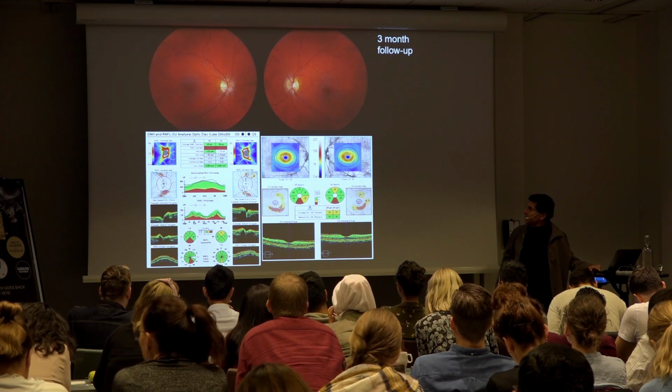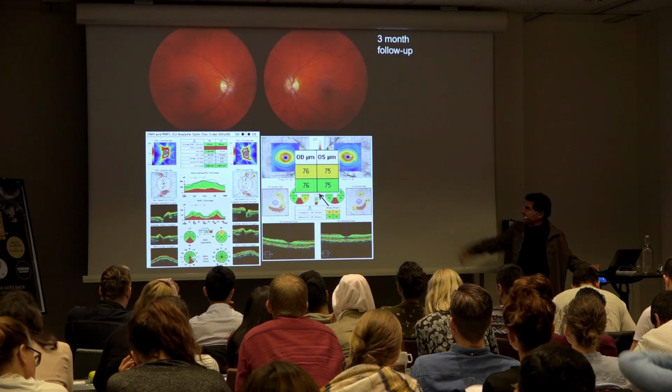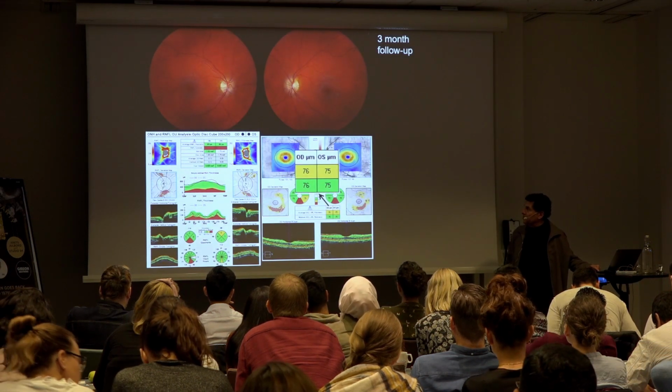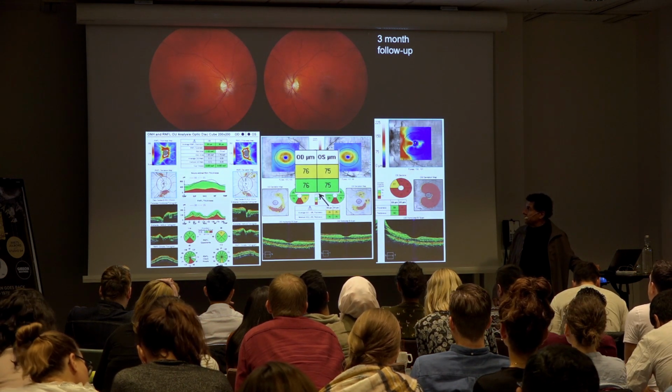So that patient had a 3-month follow-up after the disc edema went down, and you can see how the ganglion cell layer doesn't look as bad as it was before. Like it did there, same patient.